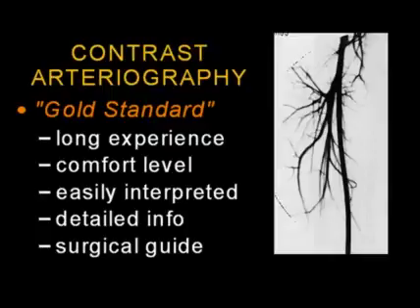As you know, contrast arteriography has long been the gold standard for evaluation and imaging of the lower extremity arteries. Interventionalists and vascular surgeons have a long experience with this technique, and they've reached a certain comfort level with the images that are required. These images are easily interpreted and provide lots of detailed information, and also serve as a great surgical guide for the performance of lower extremity bypass grafts.